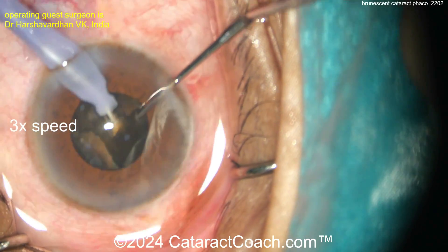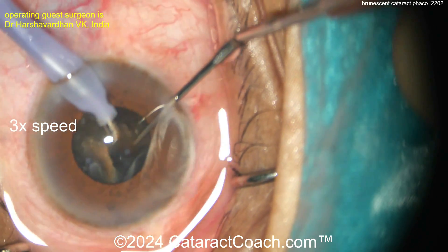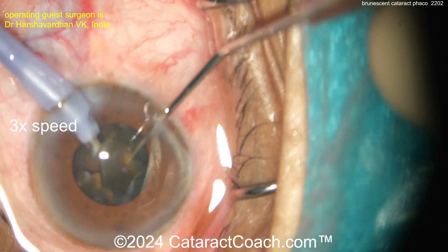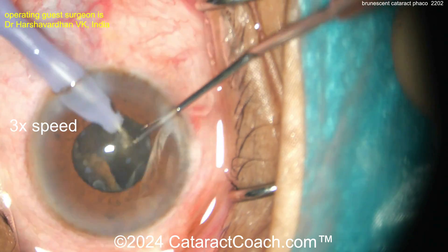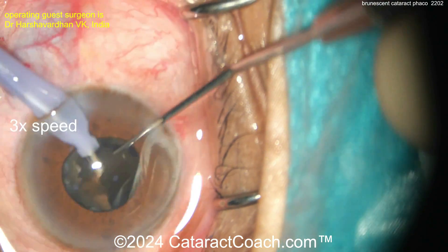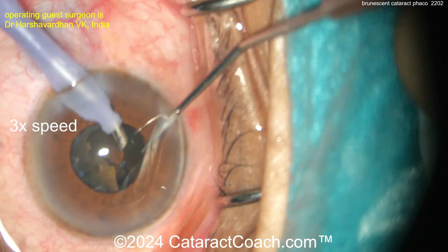Now chop, chop, and more chop — yes, we've sped the video up; the surgeon didn't have 16 cups of espresso. Taking these pieces out — look how the pupil comes down a little bit, which makes it a challenge. The surgeon is doing a great job staying central and getting all these pieces out.